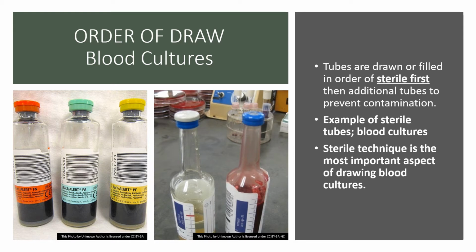So then the next one that we draw would be the anaerobic bottle, because it's looking for bacteria that grows in the absence of oxygen. So that's the order in which you want to draw those, right?